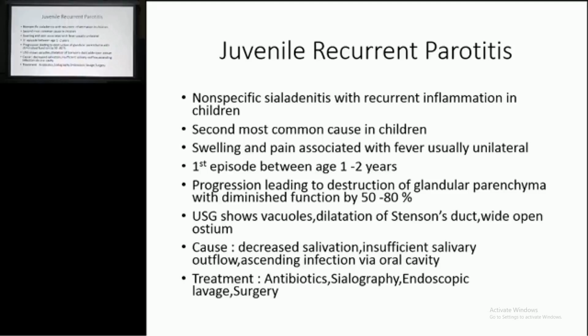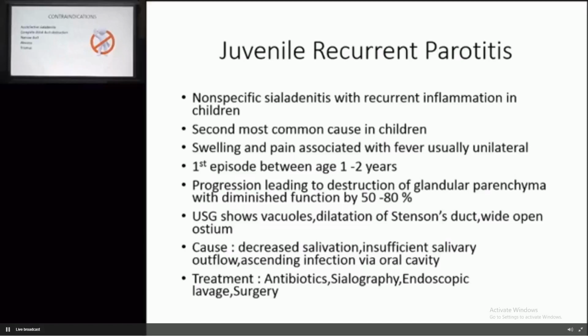ductal wall, bleeding is very high. So you should put these patients on antibiotics and then control the acute infection and then go ahead. Sometimes if there is a very narrow duct or if there is a complete distal duct obstruction, where you just cannot negotiate the duct. And as we mentioned in the morning, distal is in terms of the gland parenchyma, proximal and distal. So in these cases you will not be able to do too much.